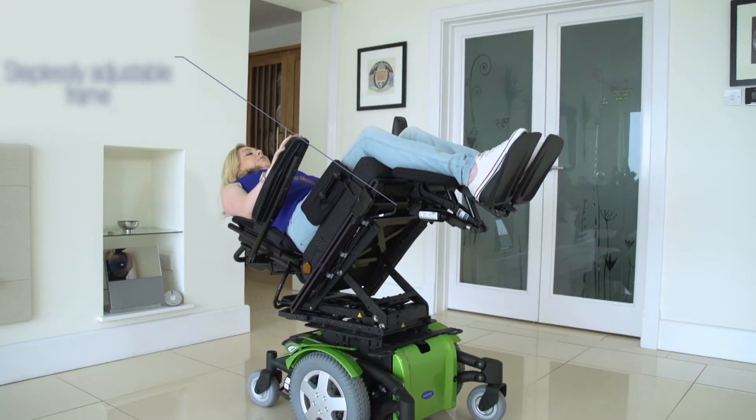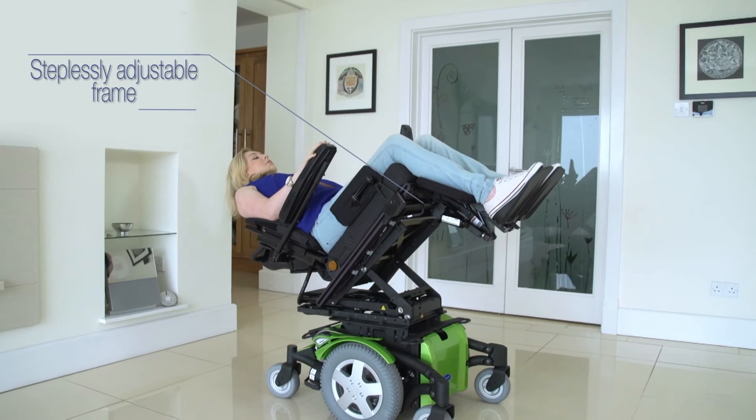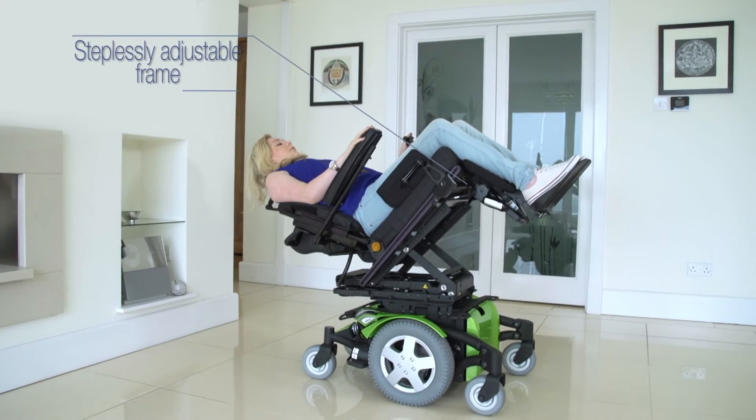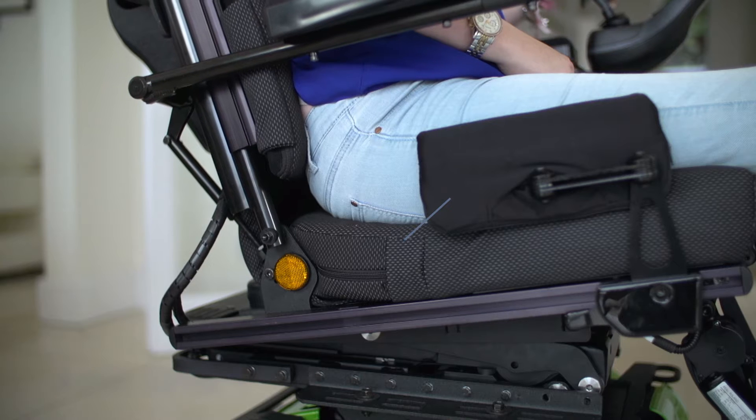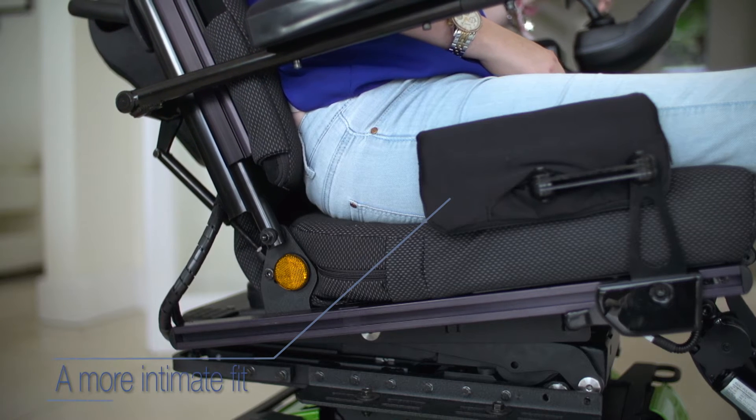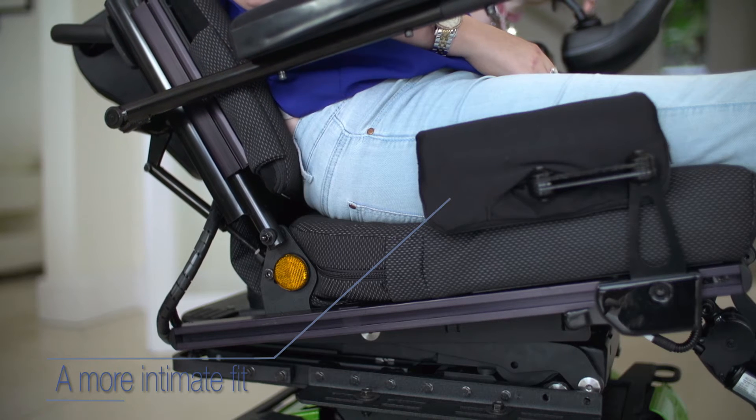It has two width and depth packages available to allow the frame to be steplessly adjusted. Easy mounting of positioning accessories like pelvic belts and hip supports allows for a more intimate fit, ensuring postural support exactly where it is needed.